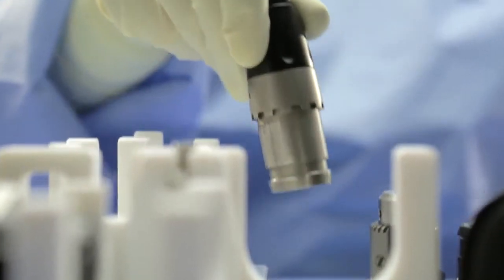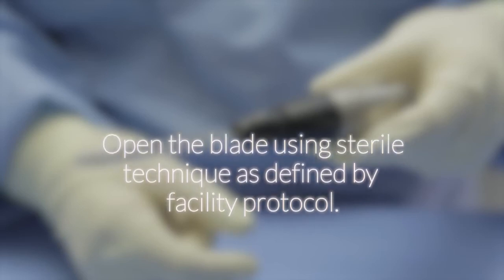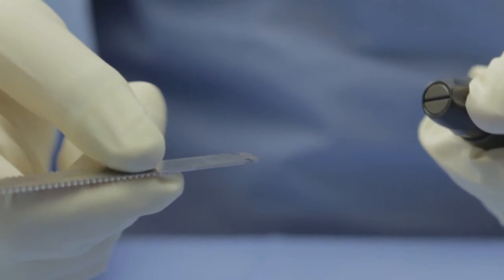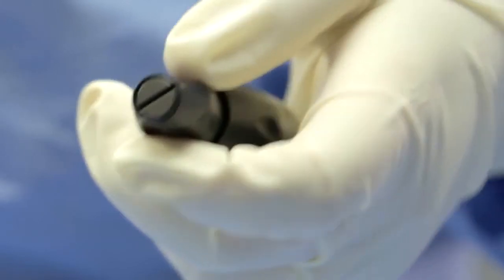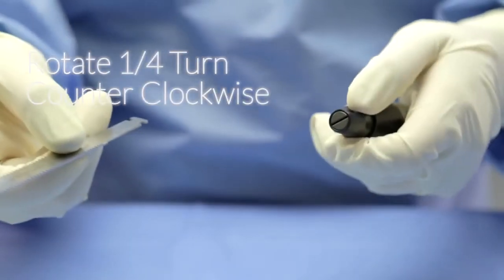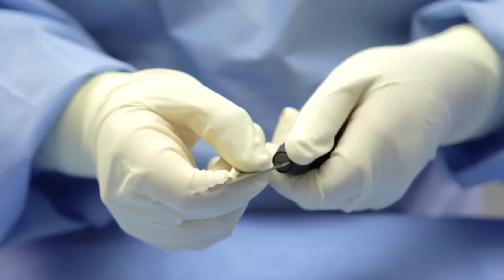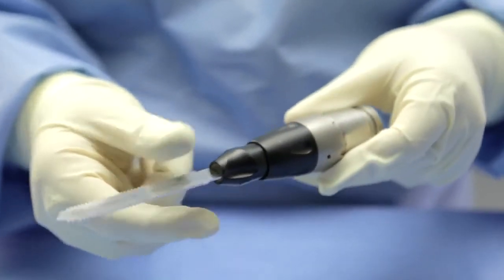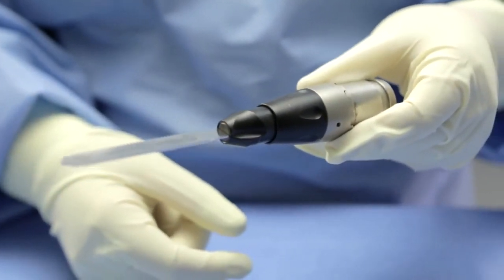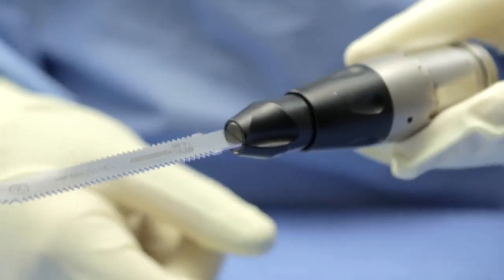Remove the reciprocating saw attachment from the lift-out tray. Open the blade using sterile technique as defined by facility protocol. If you are right-hand dominant, grasp the blade in your right hand with the hub oriented toward yourself. With your left hand, place your thumb and index finger on the end of the reciprocating attachment. Rotate the end of the attachment one-quarter turn counter-clockwise. While holding the reciprocating attachment open, slide the blade hub into the slot. Once the blade seats, release the hub. It will automatically return to the closed position. Ensure that the blade is seated by gently tugging forward on the blade.